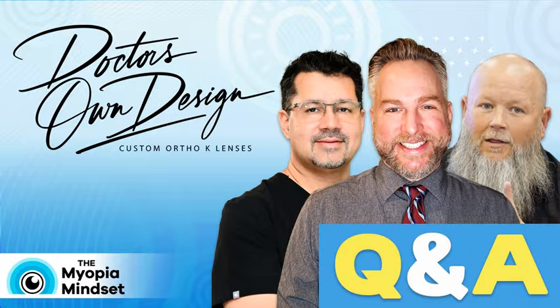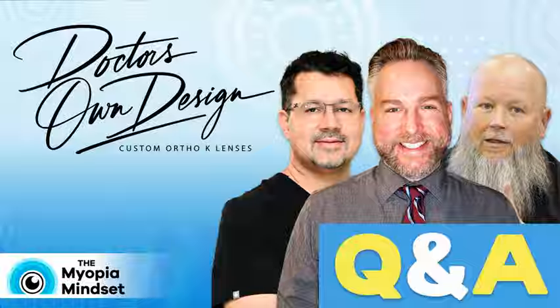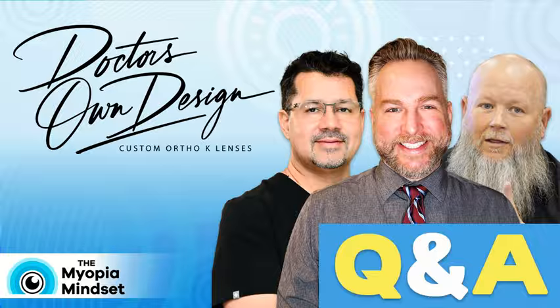But the good thing about the software is any changes I make, so Matt, you send me over, hey, this is going on, Mark, I go in there and make the changes that need to be made and I submit it. Well, now you have to review and approve that before that lens can be sent out. But it highlights every change I made. So now you go, oh, that lens was riding low and I had some bubbles in the return zone. Oh, well, they flattened the CCC and then flattened the alignment curve. That's what they did on this one.